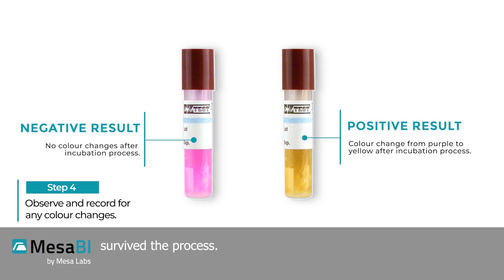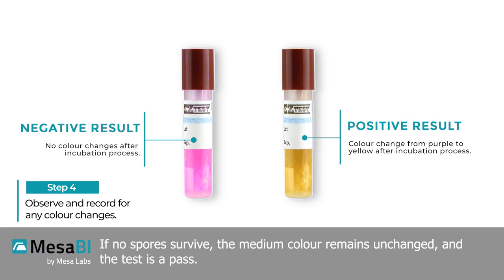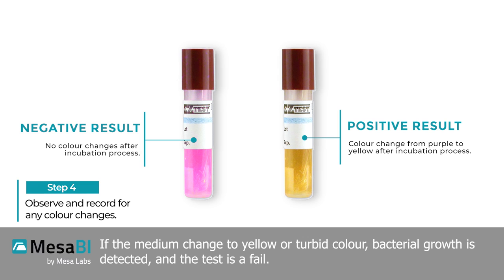If no spores survived the process, the medium color remains unchanged and the test is a pass. If the medium changes to a yellow or turbid color, bacterial growth is detected and the test is a fail.